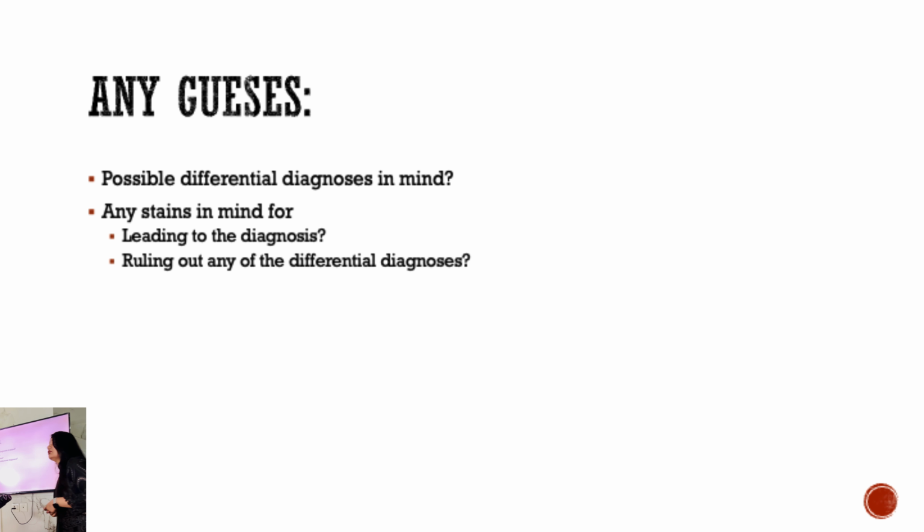A good thought. I heard synaptophysin or something like that. It was positive in one of the populations and negative in the other.